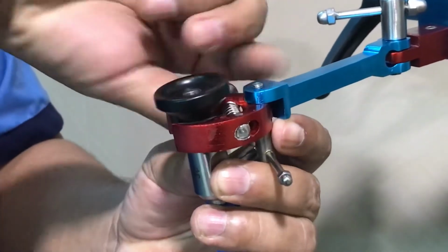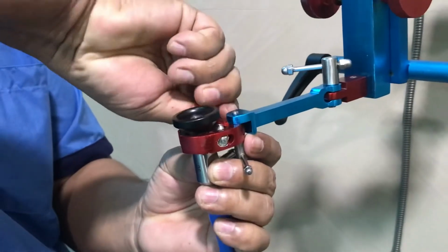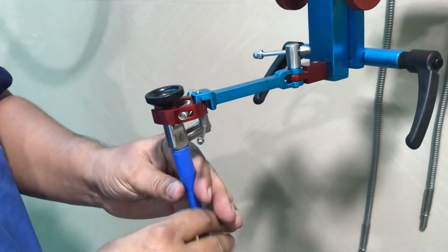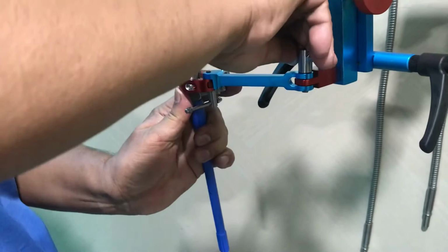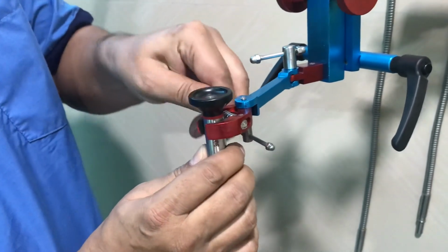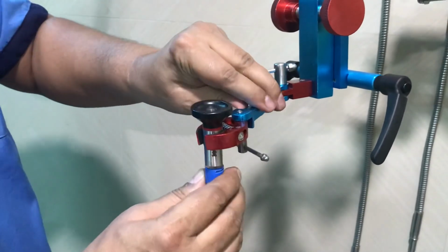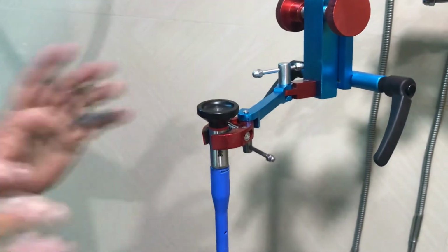And just hold the endoscope like this. So this is fixed, and in any position you can just grip it. Make sure this is holding or gripping the endoscope firmly. So make sure that. So it is fixed like this.